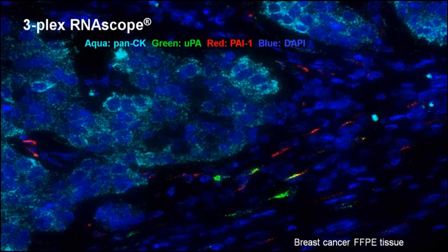In the early days of the microarrays, with not so good sensitivity, people cut out quite generously, and they had a stroma contamination, and this is what the microarray picked up, and this is what the ELISA assay was based on. Now, you see why no other technology could confirm this finding, and it really makes the statement that the tissue context for some markers can make all the difference in the world.